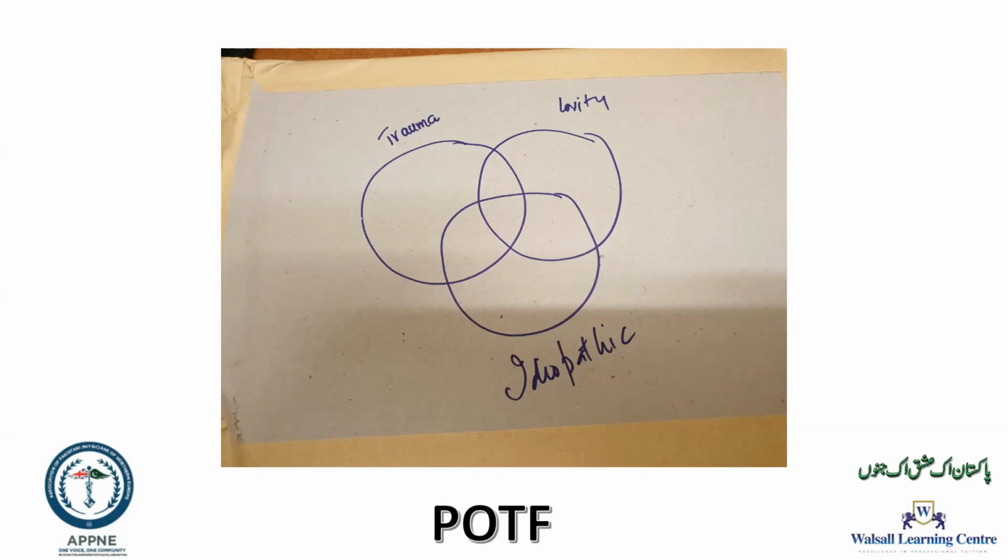Sir, I would like to have an axillary view if the patient is not very painful, or you may have a Velpeau view, or you may have a scapular Y view. All three can be taken. So all these, this is dislocated, okay? But we want to plan further. Now we know it's dislocated. So what are the two common tests you can do, and tell me what information you can get from them?